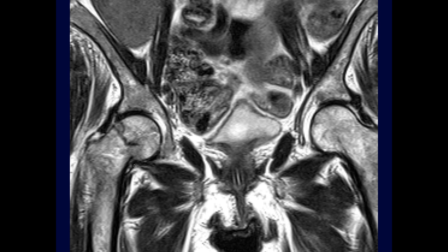And this is a case where you have to make a decision on the basis of the age of the patient. If you put in a prosthesis, especially a bipolar prosthesis where it slides on each other in two different directions, the patient does very well and gets up the same day or the day after and starts walking. If you pin it with a nail or pins, this patient won't walk for 6 months. So it all depends on age.